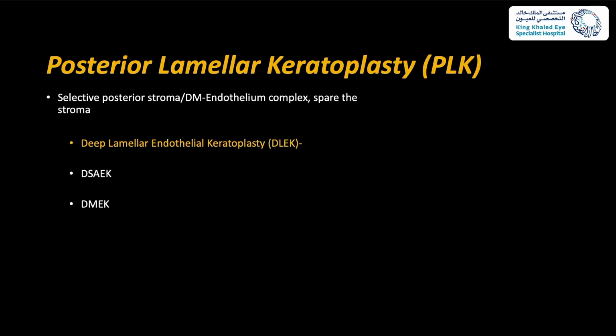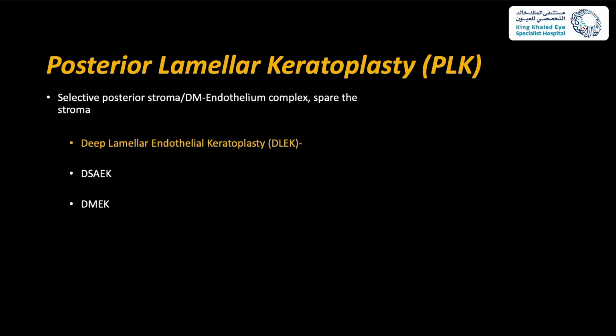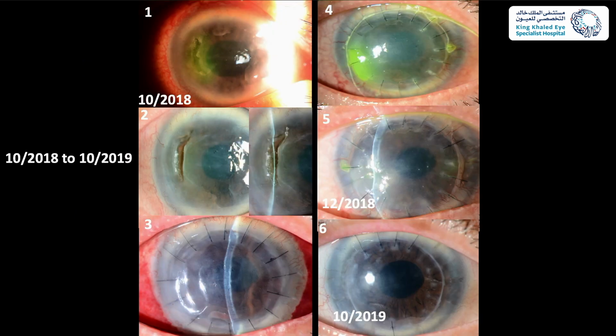Okay, so now we finished anterior lamellar keratoplasty and the application of femtosecond laser into them. I'll talk about posterior lamellar keratoplasty, and I'll focus on mainly one technique that was really forgotten, which is deep lamellar endothelial keratoplasty. I'll start this with a case.